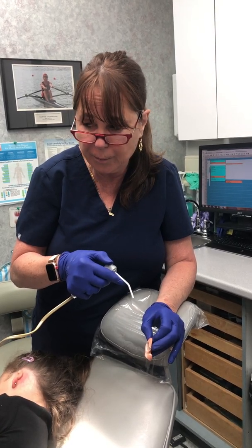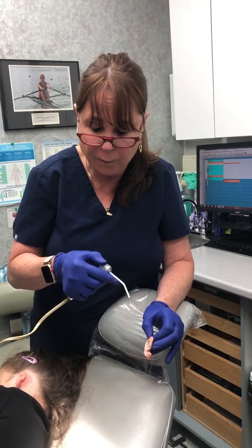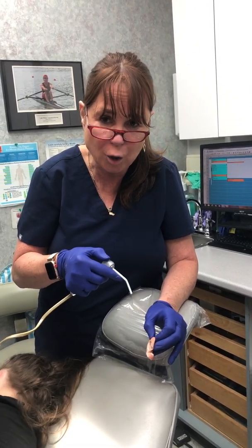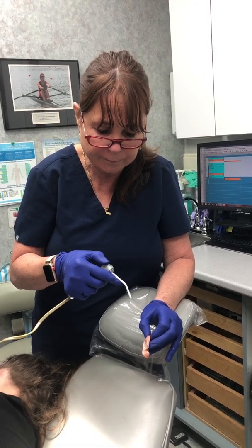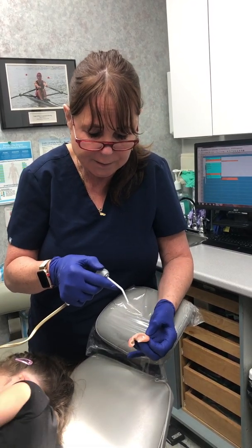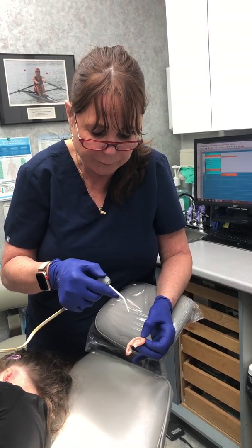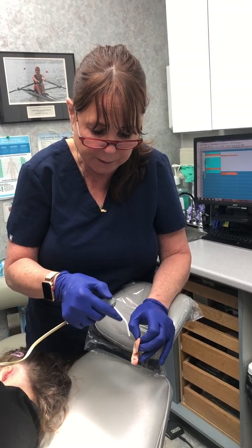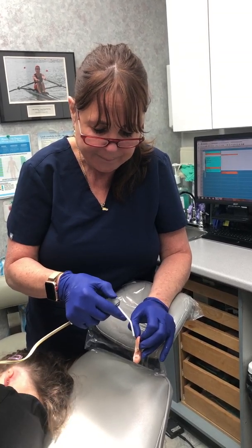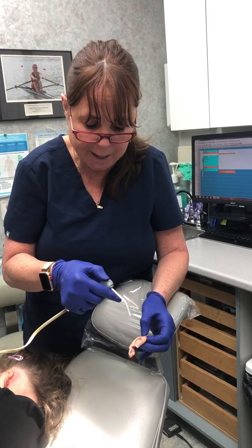Over a period of time, a couple of years, the color may change because the platinum within the silicone of the ear changes. In a couple of years, we'll need to make a new ear. But right now, this is S's ear, and I can't wait to see how beautiful and how amazing she is going to be. She's a gorgeous child to begin with, and she is just going to be the toast of the town.